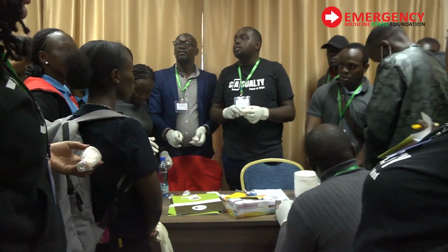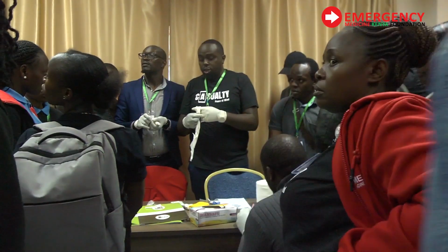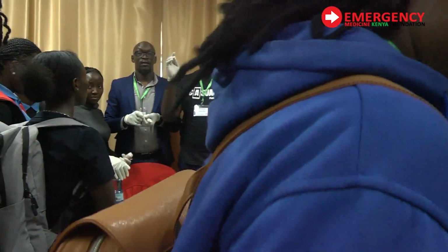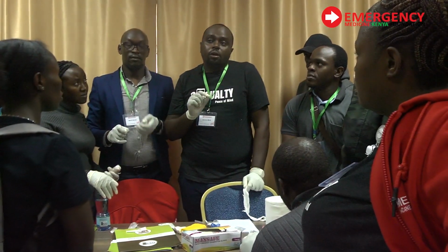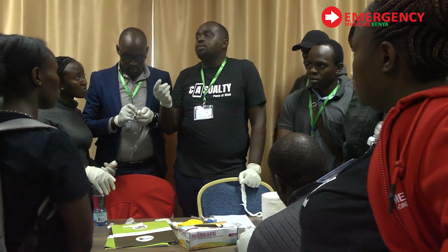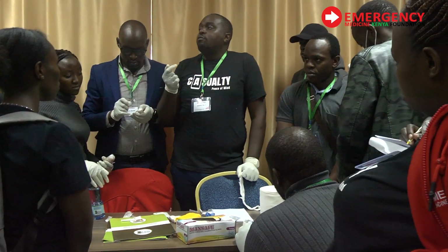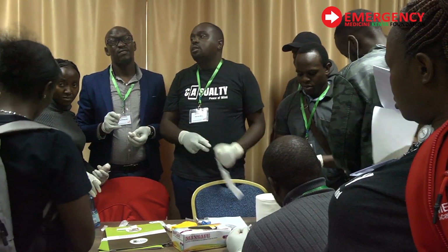Another question, yes? That's a very good question. Before you put intraosseous access, do you need to give local anesthetic? The answer is, it will depend on the clinical scenario. If your patient is unconscious, GCS of 8, you don't need to do that. But if your patient is conscious, of course there will be pain. So you can numb around and put your intraosseous access.